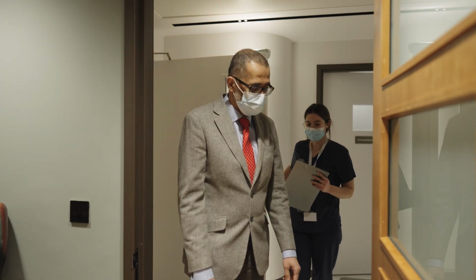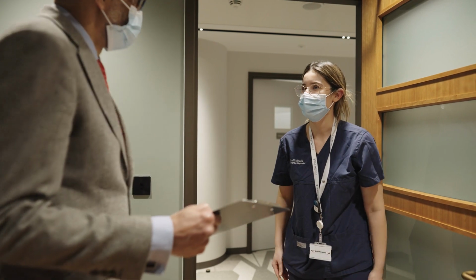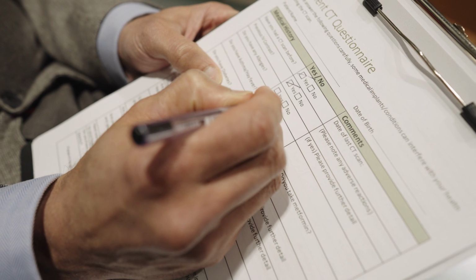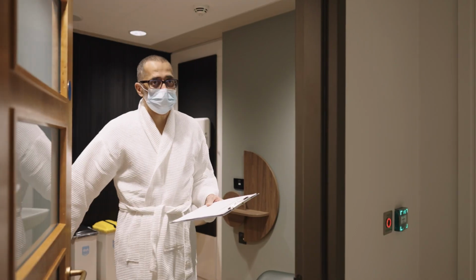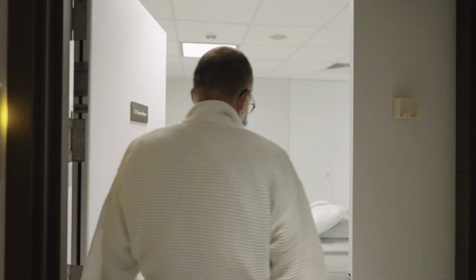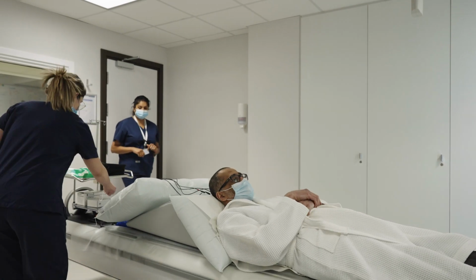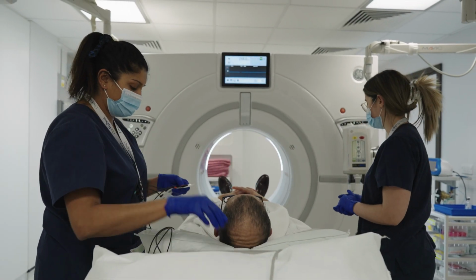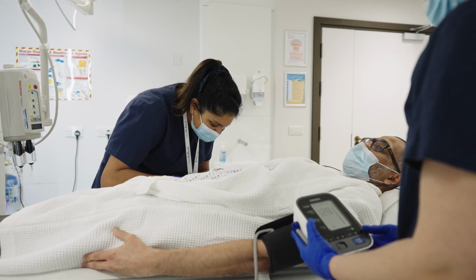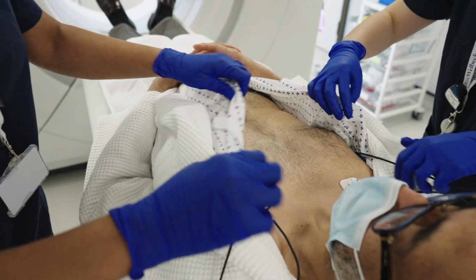At that stage, I filled out another form asking really about whether I was allergic to the contrast going to be given, and if I needed a beta blocker to slow my heart rate down, whether I would be okay with having that injection. I got changed and was shown into the CT scanning room itself. I lay down on the bed, very comfortable in fact. Apparently it's slightly curved to provide more patient comfort, and had a drip placed in my arm. I had a blood pressure taken on the other side and an ECG lead attached. And after that, I was told what would happen when I'd go into the scan.